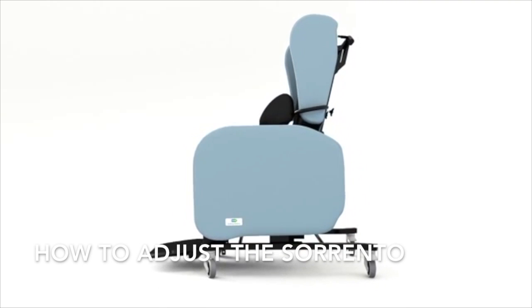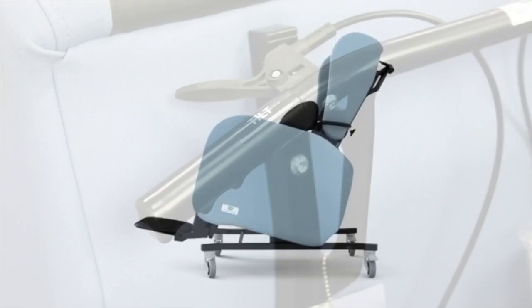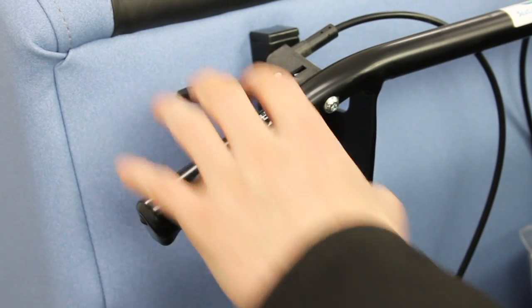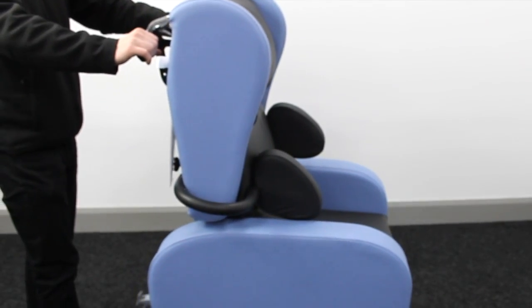How to adjust the Sorento. To tilt the chair, activate the tilt release cable on the left hand side, located on the push handle, and pull back to sit your client.